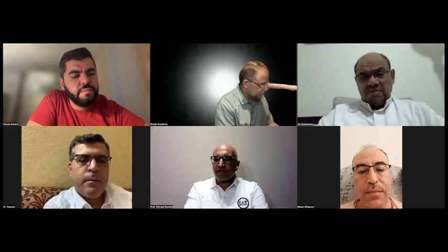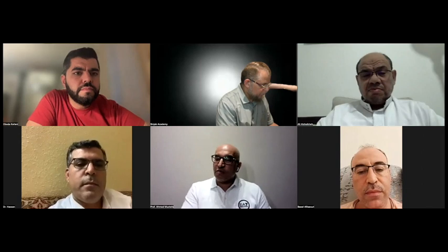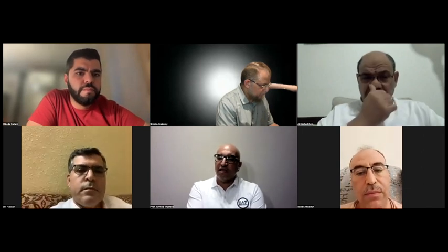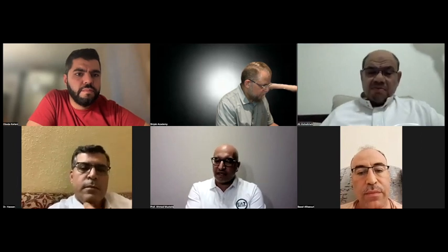Exactly. You know, Dr. Bassel, sometimes you have patients with insufficient iris tissue, and you need to have the tube resting on the iris. Then you are obliged to move the tube in an oblique direction to have the tube on the iris. Thank you very much for this. Thank you very much, Dr. Bassel.